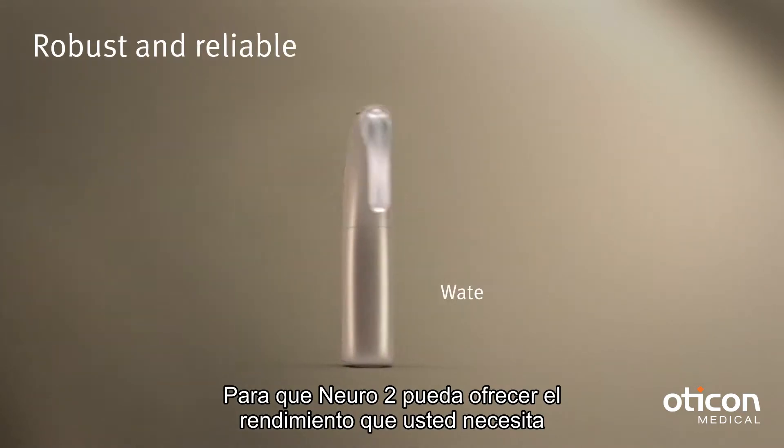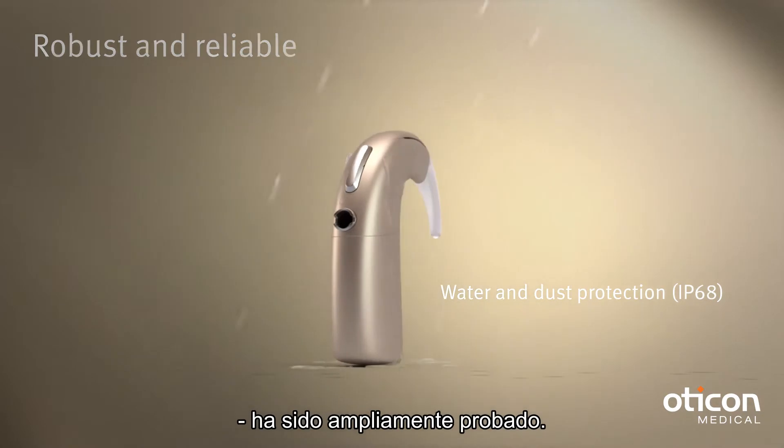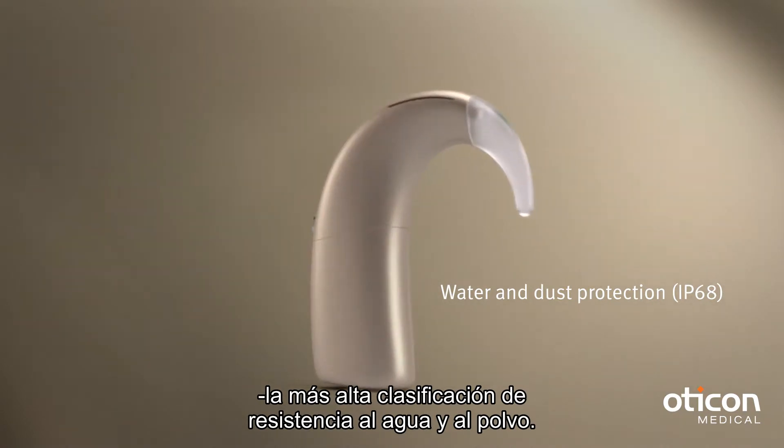To make sure the Neuro 2 can deliver the performance you need, it has been extensively tested. In fact, it has achieved an impressive IP68 rating — the highest classification against water and dust.